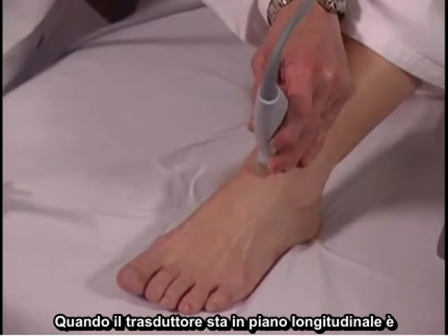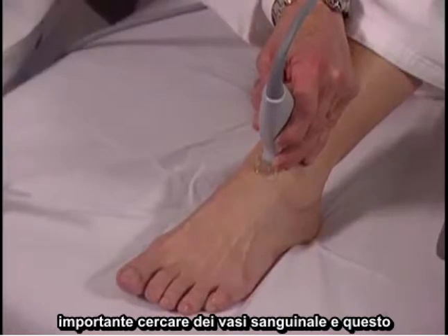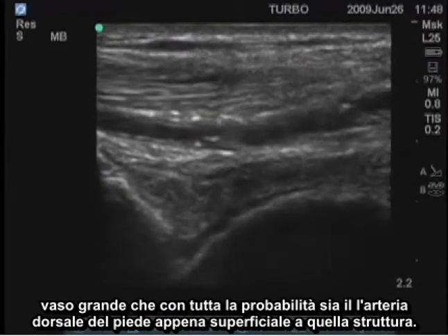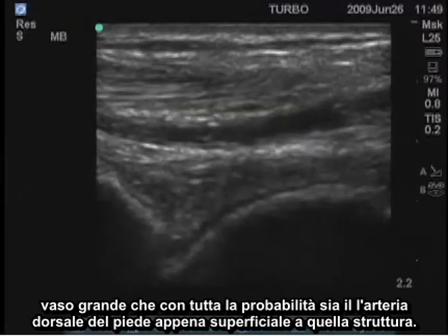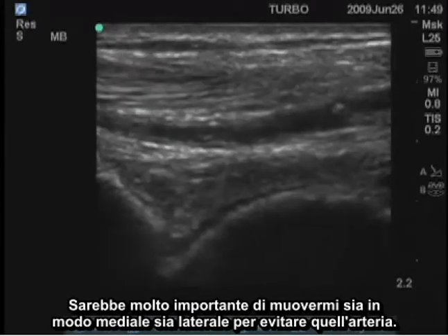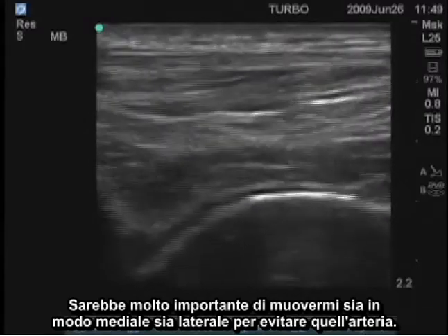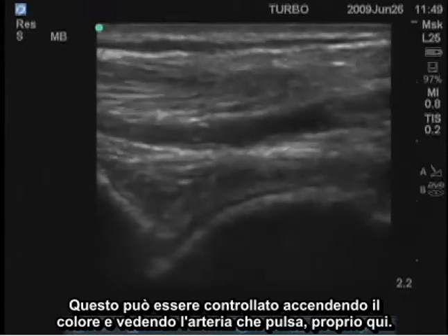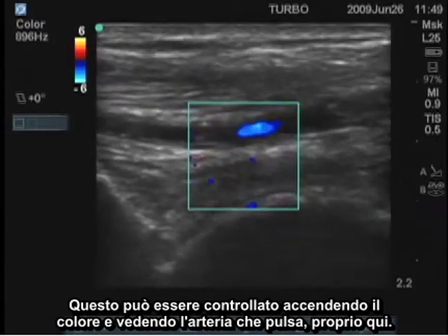When the transducer is in the longitudinal plane, it's important to look for blood vessels. This large vessel, most likely the dorsalis pedis artery, is right superficial to that structure. It would be very important to move either medially or laterally to avoid that artery. This can also be checked by switching on the color and seeing the artery pulsating right there.